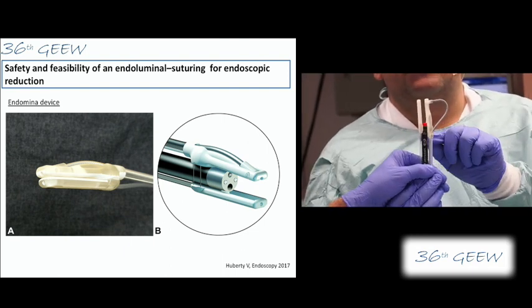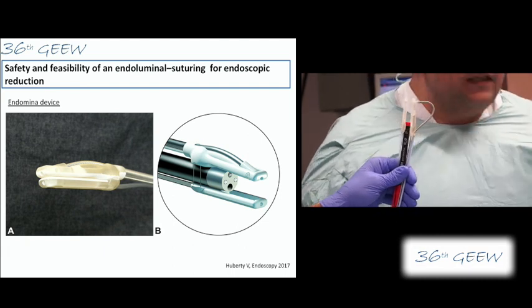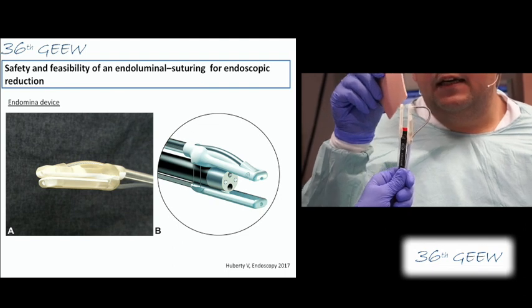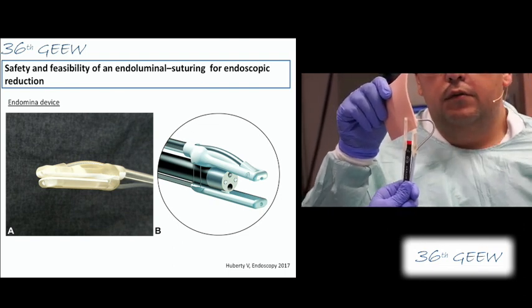So we have the scope here, we have the bendable arm with the needle inside. The needle contains an already pre-loaded suture with two tags.